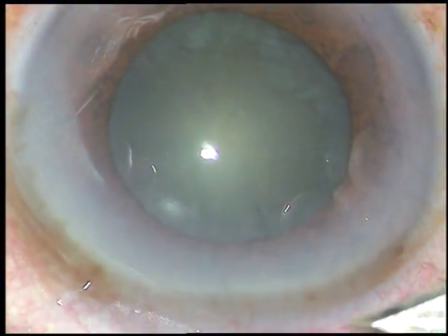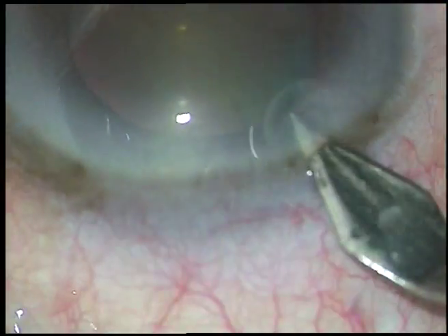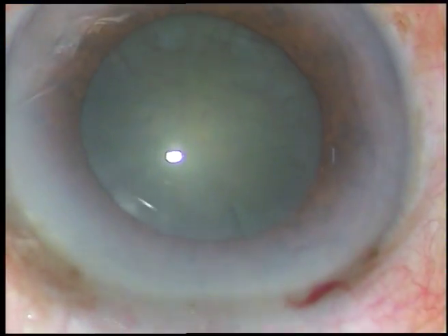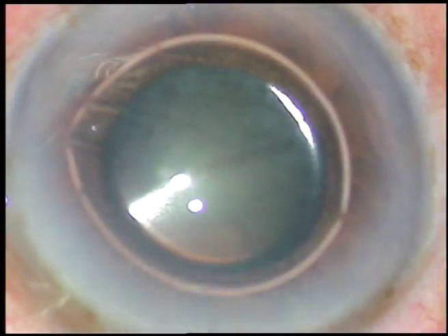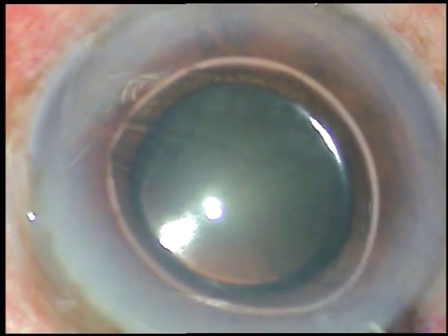Friends, this cataract is of medium density. Nucleus sclerosis is about grade 3. The pupil is mid-dilated, with a size of approximately 4.5 mm. I have taken up this case for surgery.